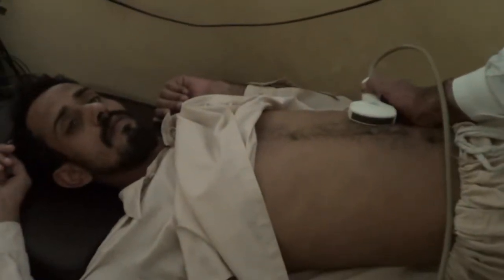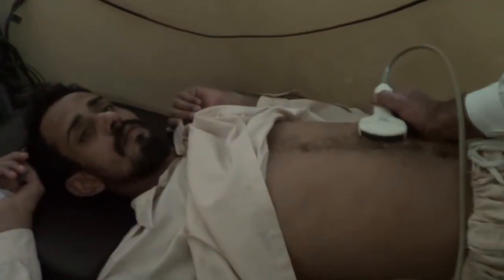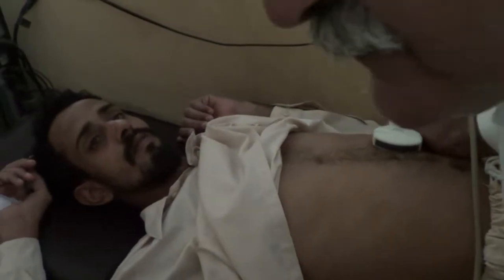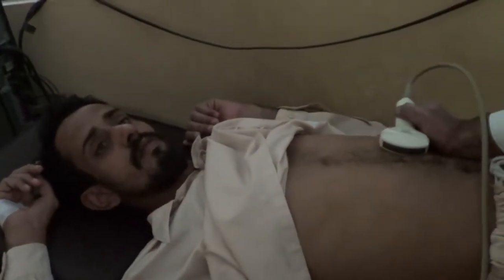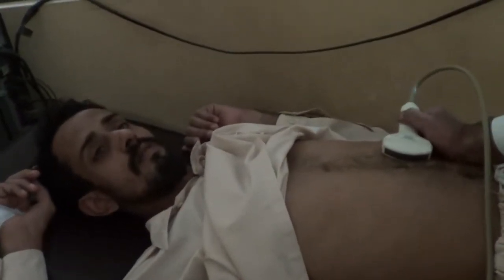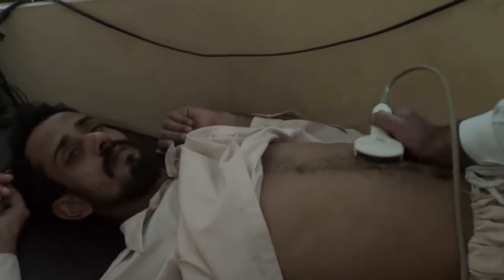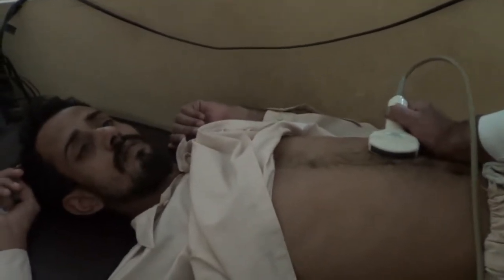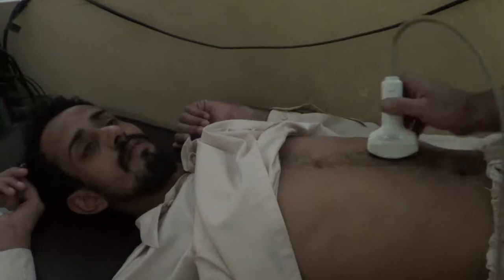This is an ultrasound study of a 27-year-old male presenting with a history of P.E.O. for the last two months. Now let's scan it.